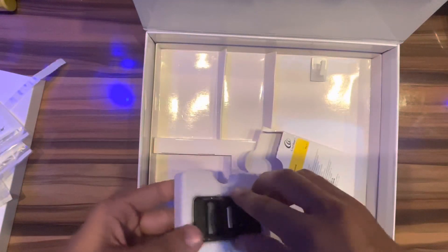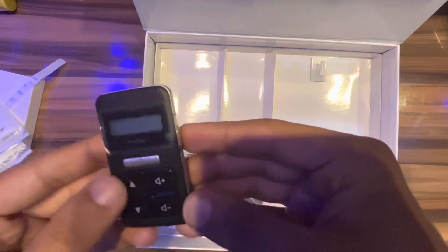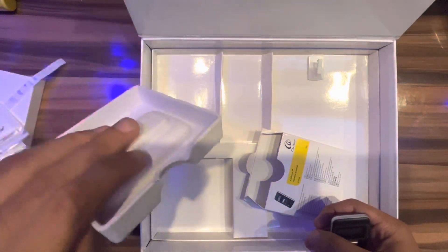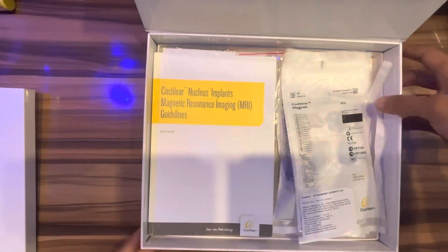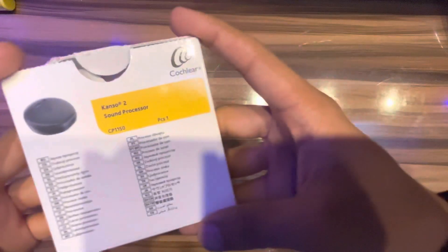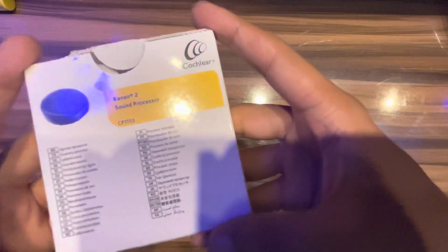It is not needed if you have a smartphone to control. Okay, now let's do the unboxing of the Kanso 2 sound processor. Let me open this.